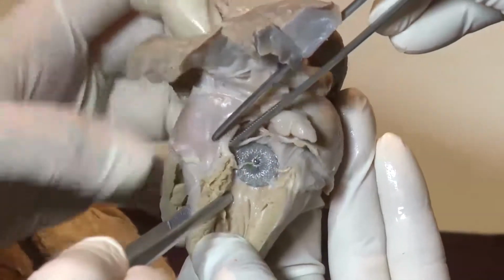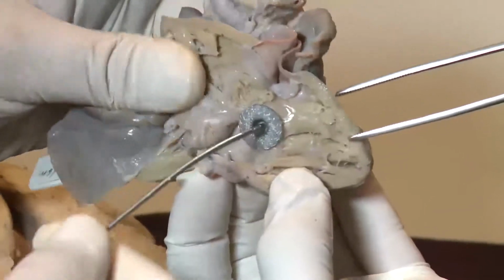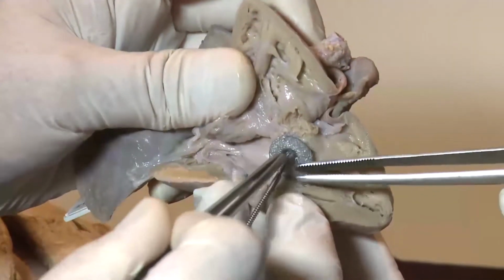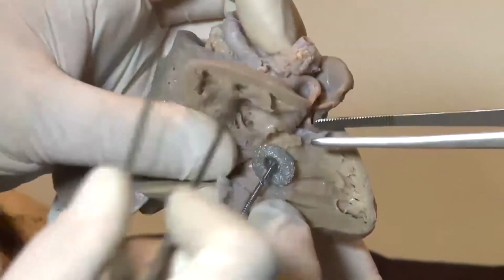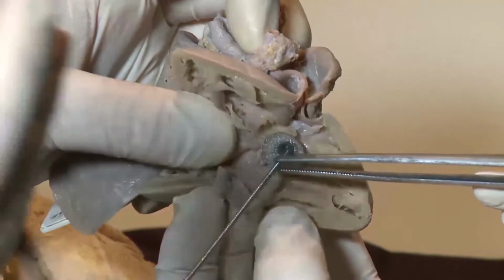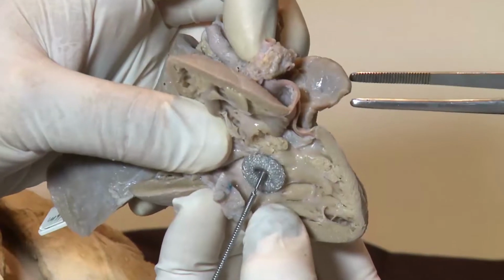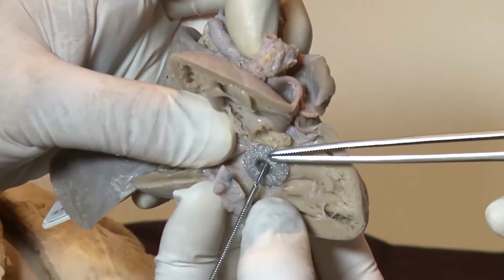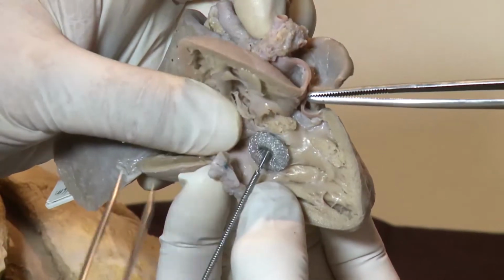On the right side, this device covers the whole area. The AV bundle traverses under this device. So if the distance between the two discs is too short, as time passed, it flattened and compressed the AV bundle. So one mechanism is compressing the AV bundle, and the second one is that fibrotic change may cause the AV block.